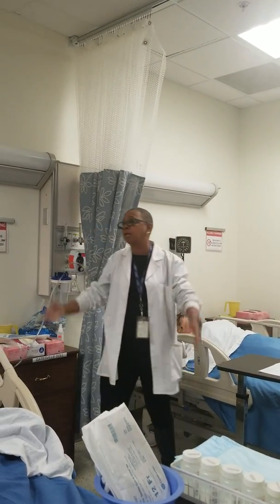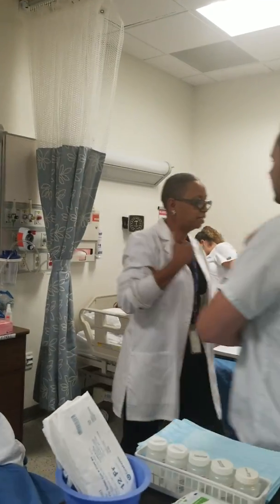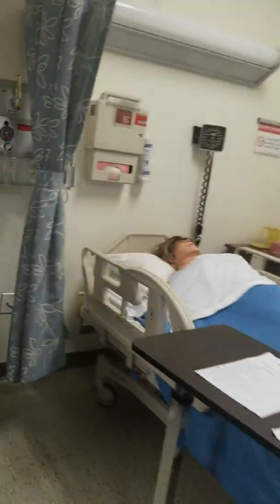I know this. Y'all need to come closer. Come closer, people. You can't see this. Go and look at, what does it say? Off, and y'all know I get hands on. What does it tell you?